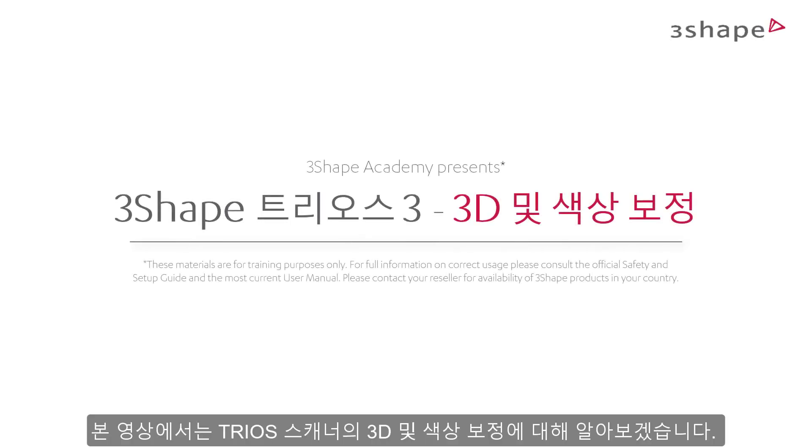In this video, we will go through the steps of 3D and color calibration of the TRIOS scanner.